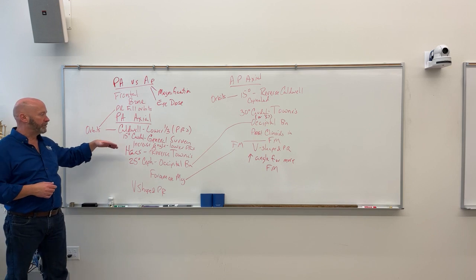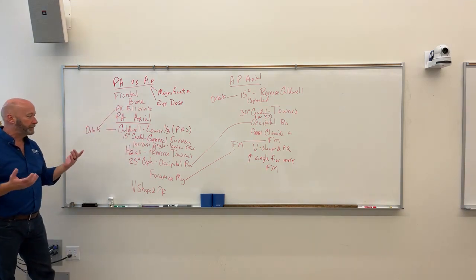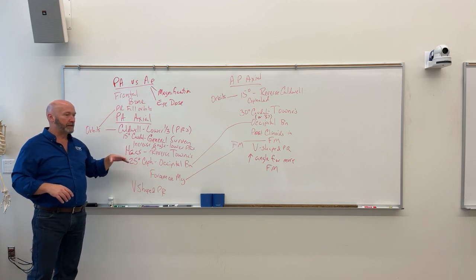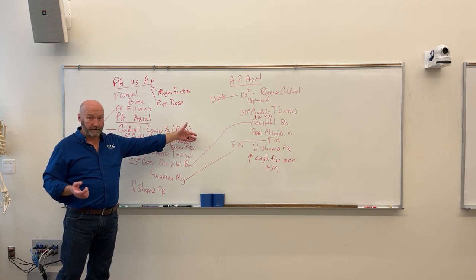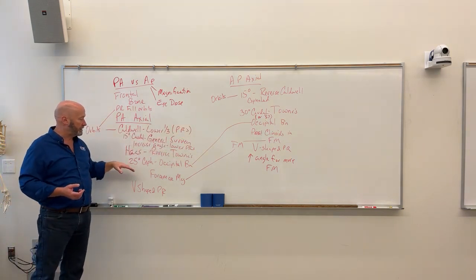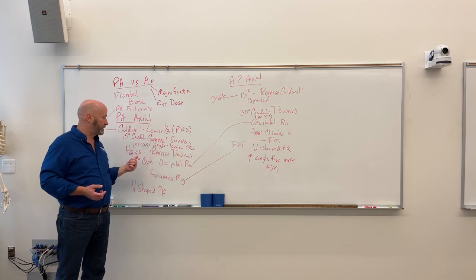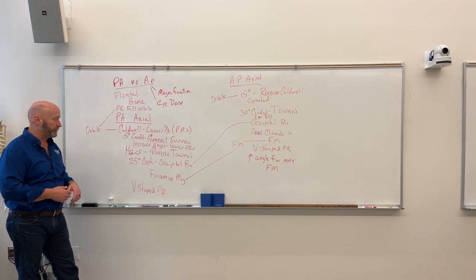So the Caldwell, we're still kind of looking at the frontal bone, but we can see a little bit more stuff, right? So the Caldwell, general survey, frontal bone-ish. The Haas, though, is going to be the reverse of the more common view that we're going to take, and that is it's going to be the reverse of the Towns. So what we're going to utilize with the Haas is a 25-degree cephalic angulation. And because we're looking at the occipital bone on the Towns, if the Haas is a reverse of the Towns, then naturally we're going to be seeing the occipital bone there too.